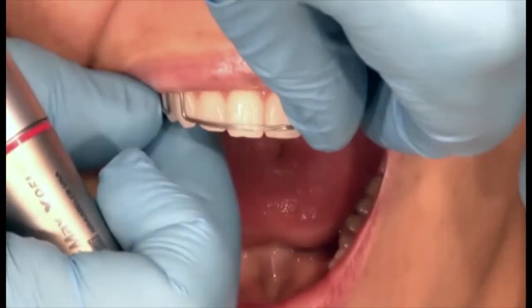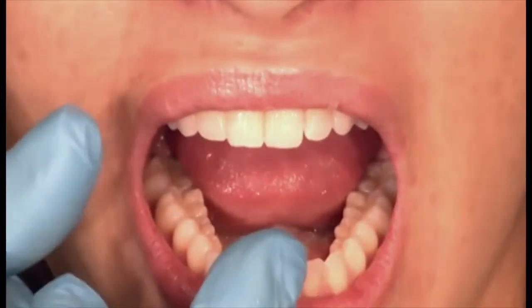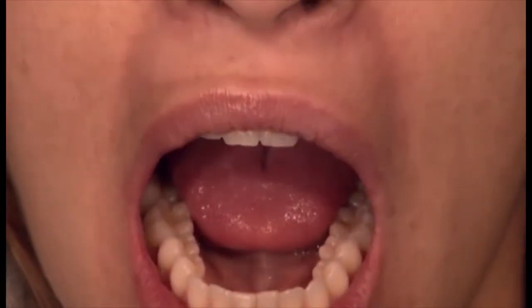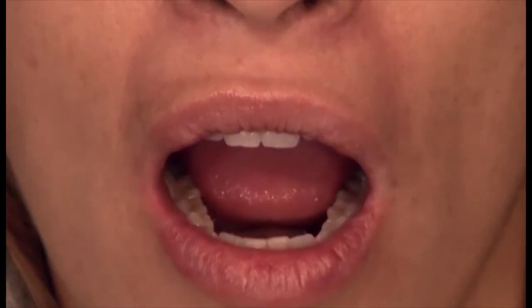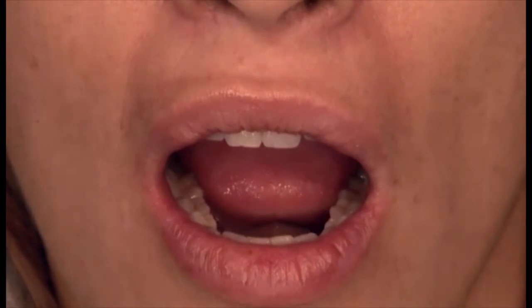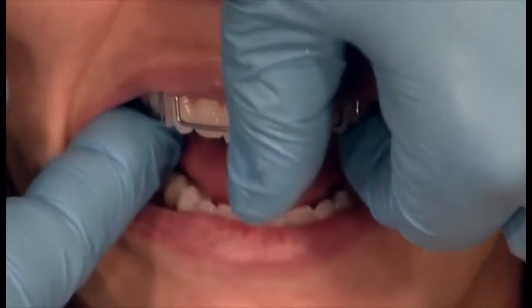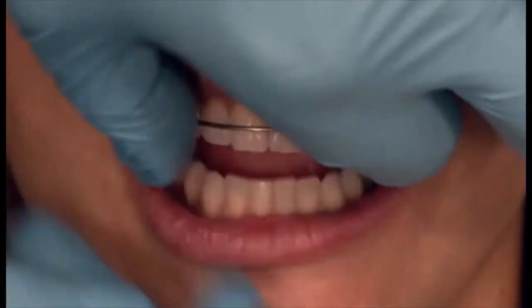Okay, I'm going to take the platform out. Don't touch your teeth together. We're getting actually very close. This red mark on the platform is moving very close to the lingual of the anterior teeth. So she's getting very, very close.